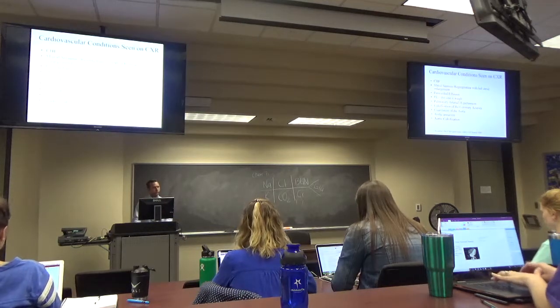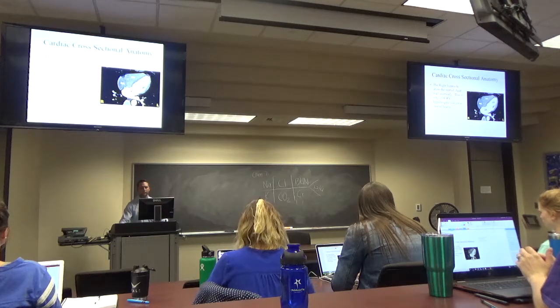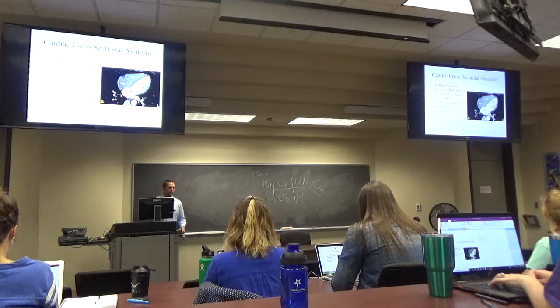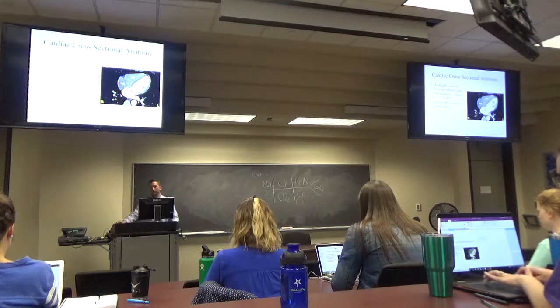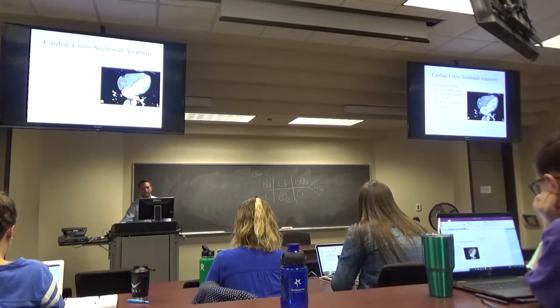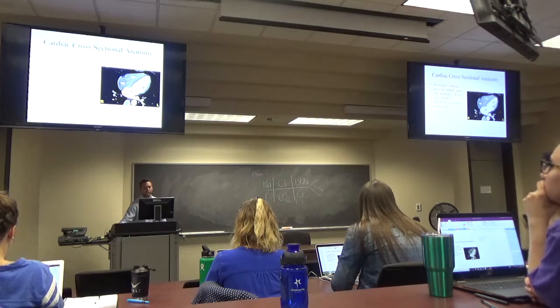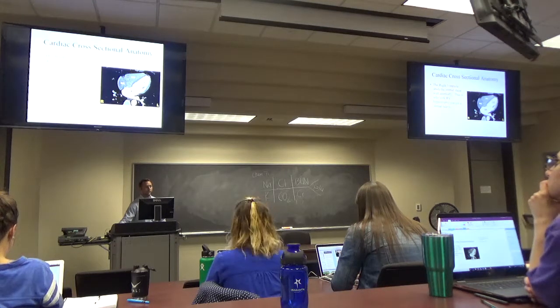So, could you go back to that? Sure. Where are we looking? What is this? This is a cross-sectional picture of a heart. This is an axial CT scan. When you're looking at a CT scan, you imagine that someone is transected, like right here, and you're looking up at them. So this is the anterior wall, the chest wall, the front of your chest. This is the left side of your body, the right side, and this is your back. So here is a vertebral body, aorta, the left atrium is posterior, the left ventricle is posterior, and the right ventricle and right atrium are both anterior to that.